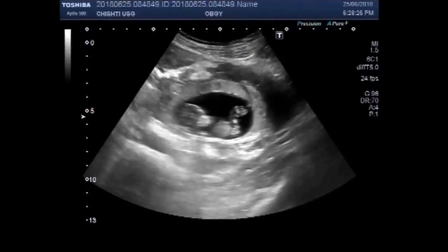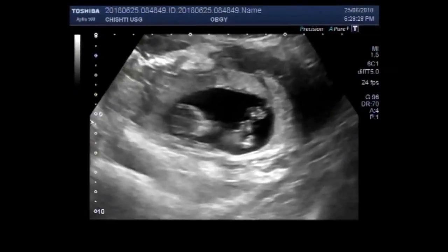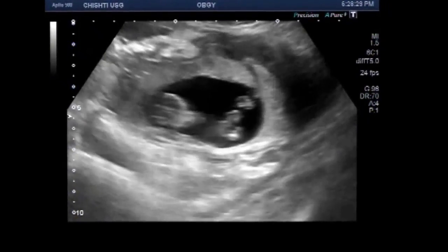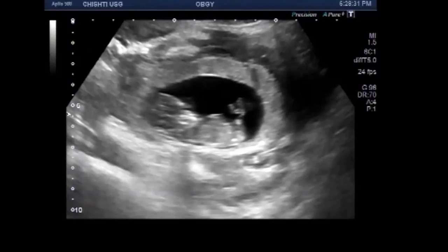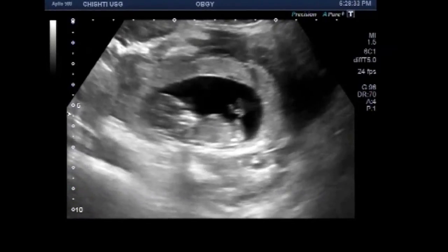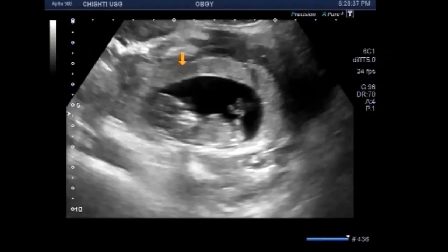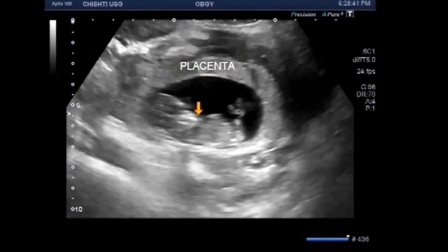You can see the fetal movements. Fetal cardiac activity is also visible and audible. This is the placenta and this is the fetus.